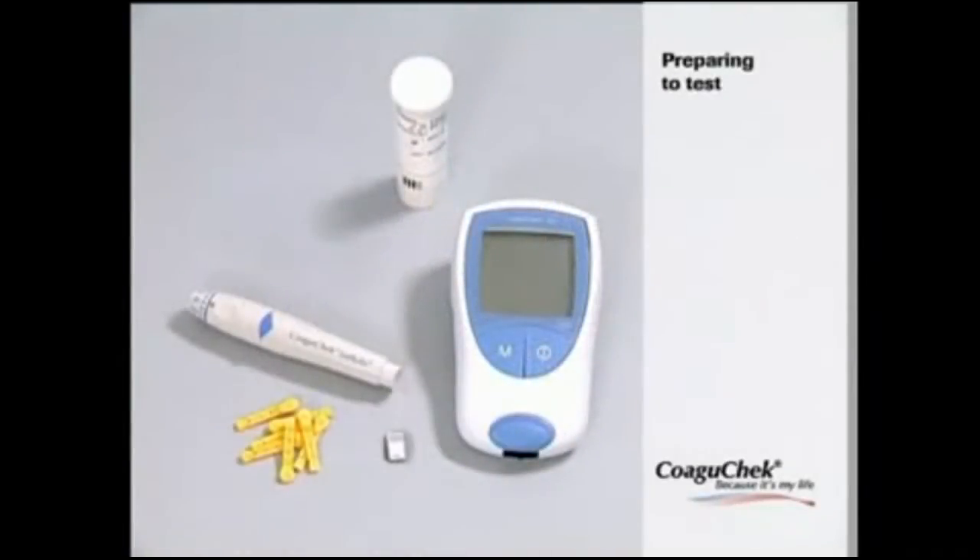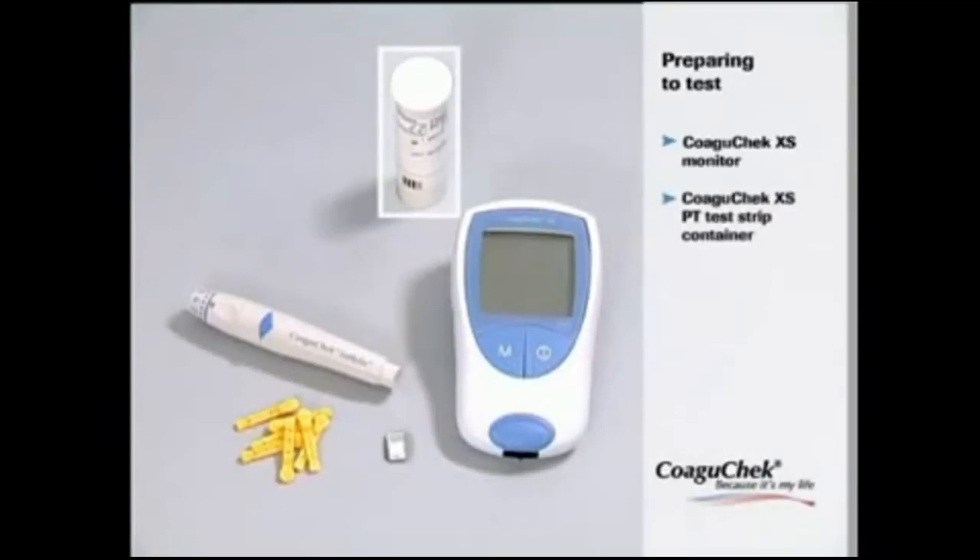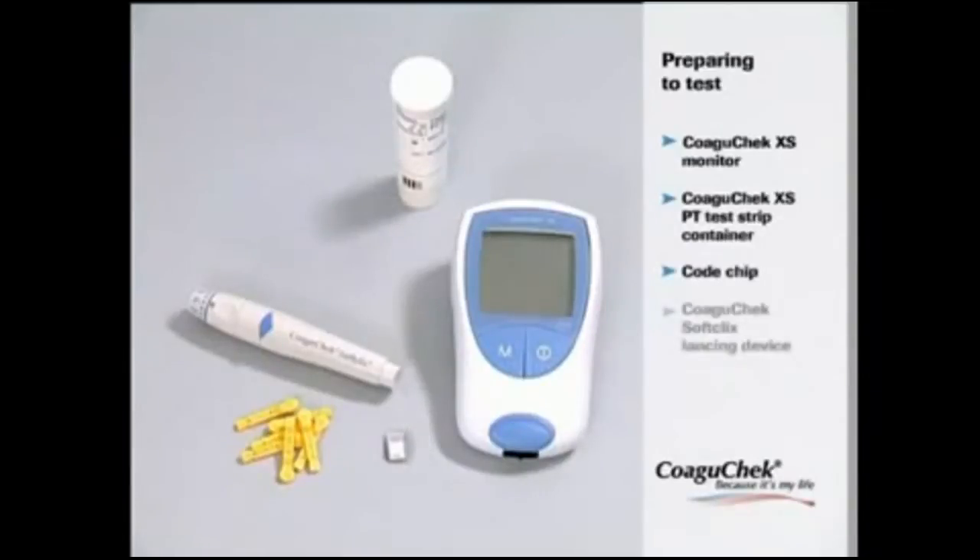Let's start with preparing the test. Please have the following items nearby: the Coagucheck XS monitor, the Coagucheck XS PT test strip container, the code chip belonging to these test strips, the Coagucheck SoftClicks lancing device, and the Coagucheck SoftClicks lancets.